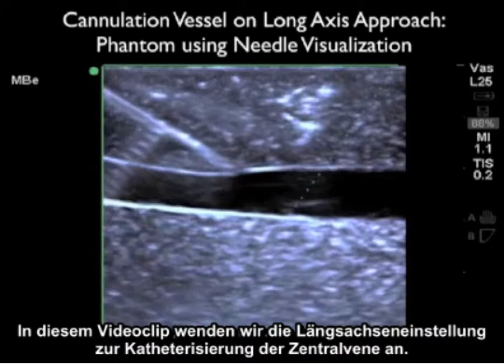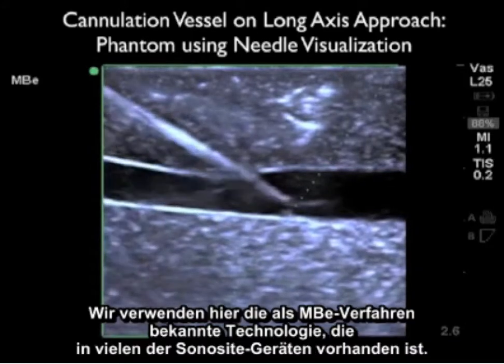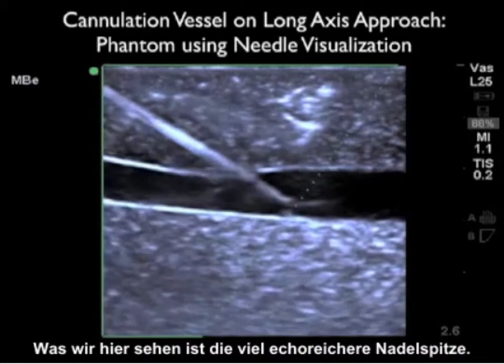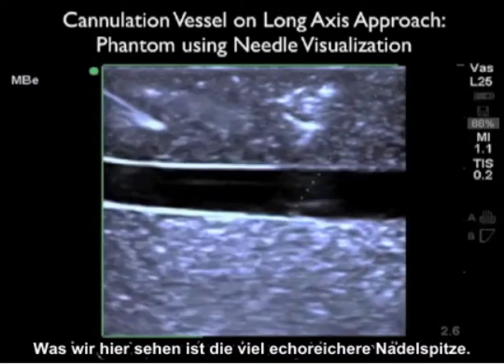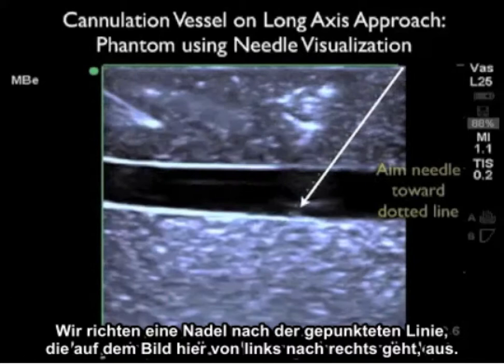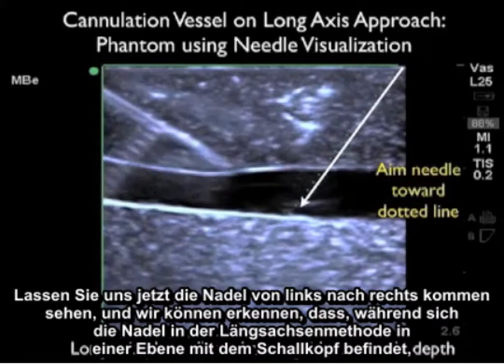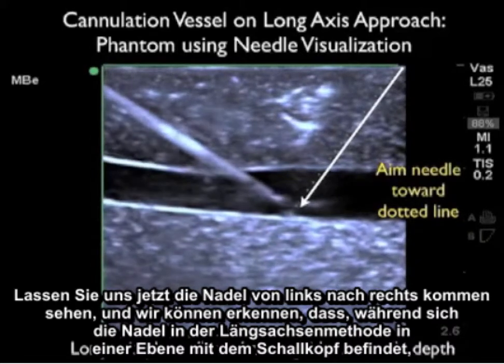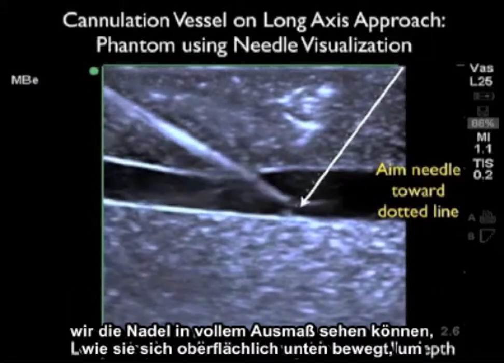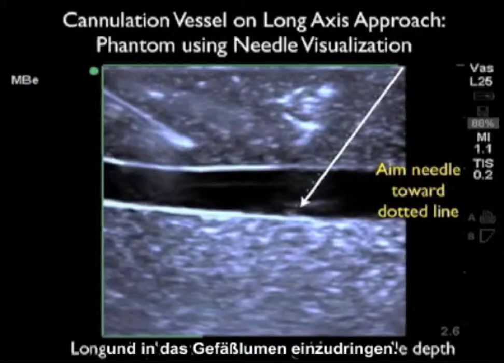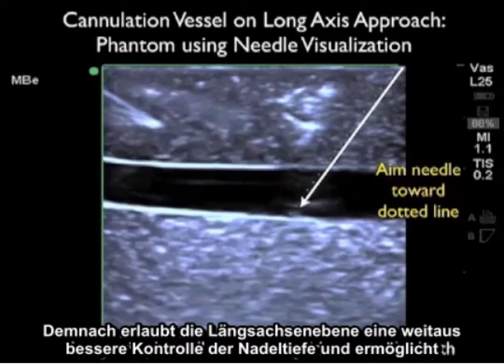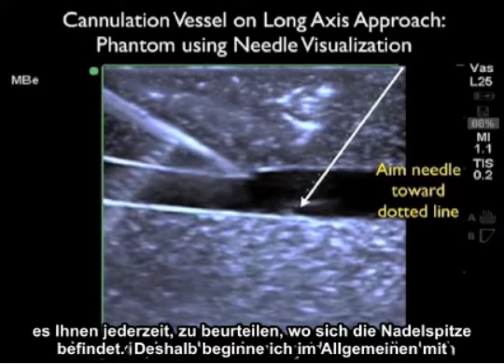In this video clip we use the long axis approach for cannulation of a central vein, employing MBE technology available on many sonosite machines, which makes the needle tip much more echogenic. The needle is aimed towards the dotted line on the image. Watching the needle come in-plane with the probe from left to right in long axis, we can see the full extent of the needle as it travels from superficial down to permeate the anterior wall and enter the vessel lumen. The long axis plane allows much better assessment of needle depth and lets you gauge the tip position at all times.